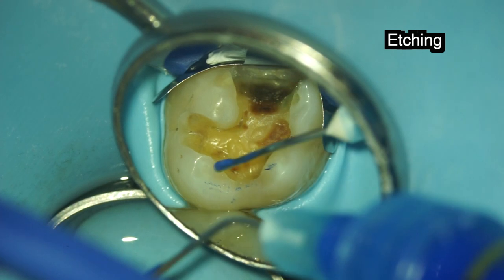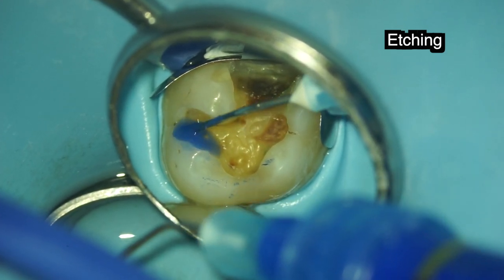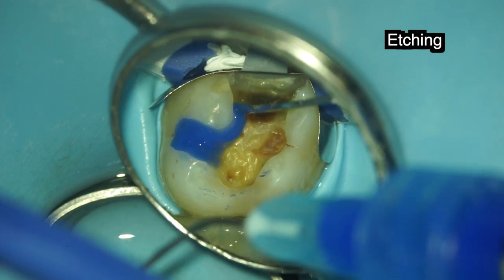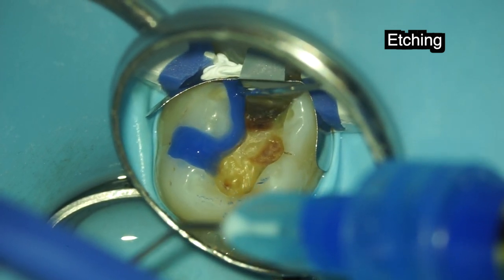Next, I will etch with some phosphoric acid to make the enamel susceptible to bonding. The bonding is basically the glue between the filling and the tooth.